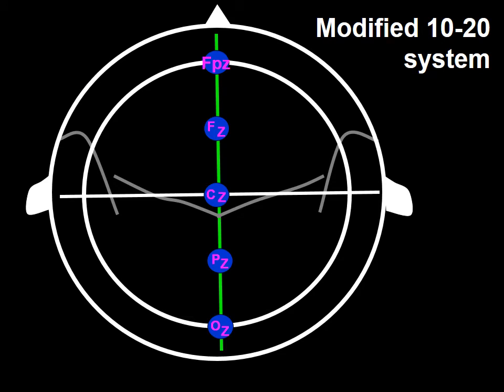I have in this frame colored the midline line in green, added blue circles to indicate electrodes, and introduced letters as labels. I added the blue circles to give you an idea of how the head would look after the placement of midline electrodes.